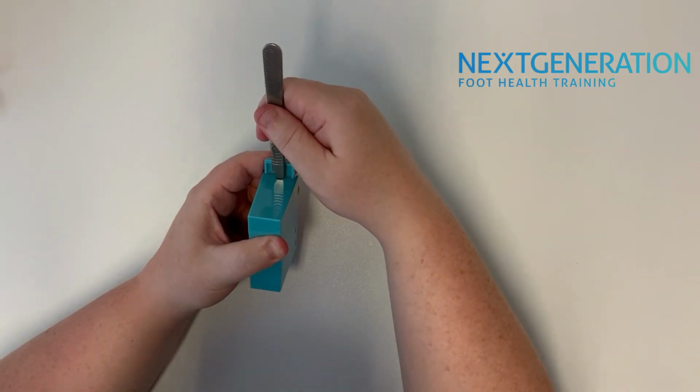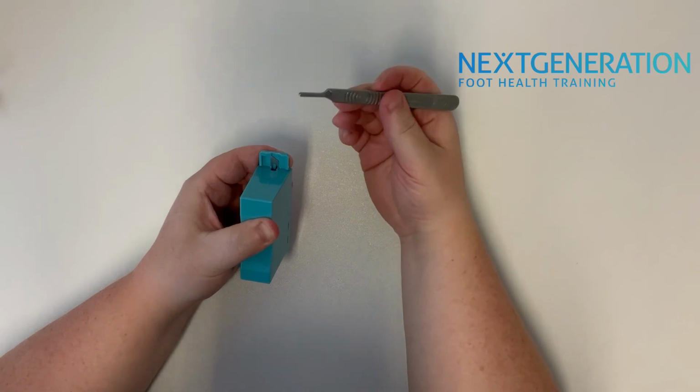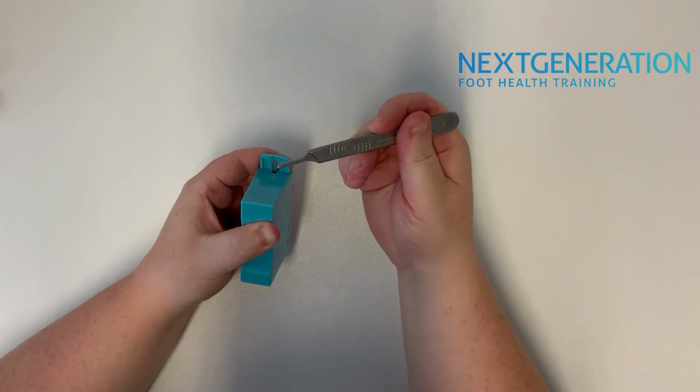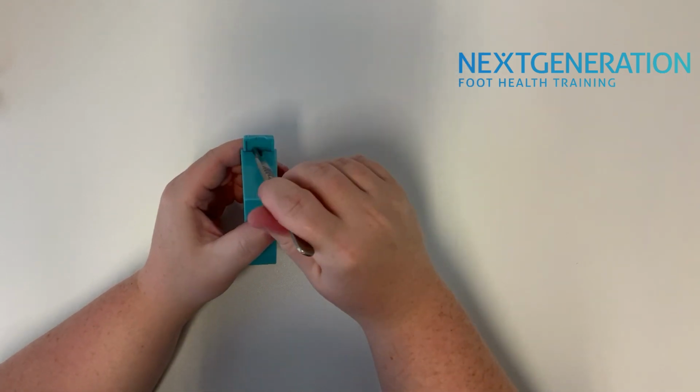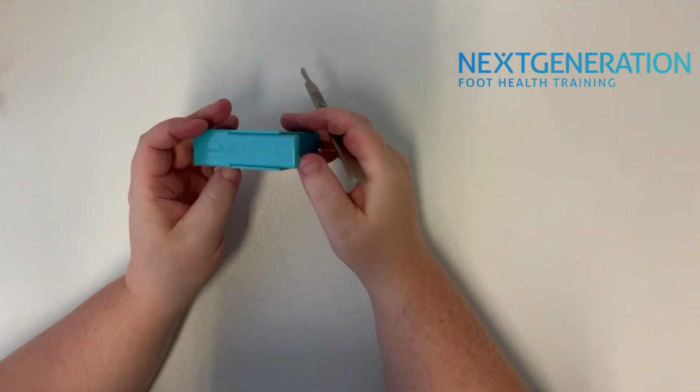Going to give it a pull in that direction, brings the blade off. Always double check that the blade has come off the handle piece. Blade is in the box, release the pressure, give it a shake, and in it goes.